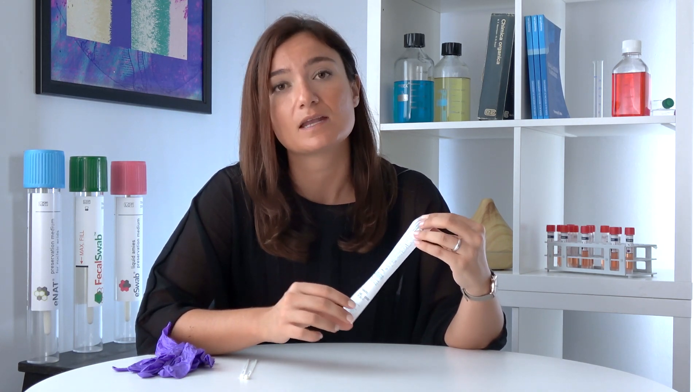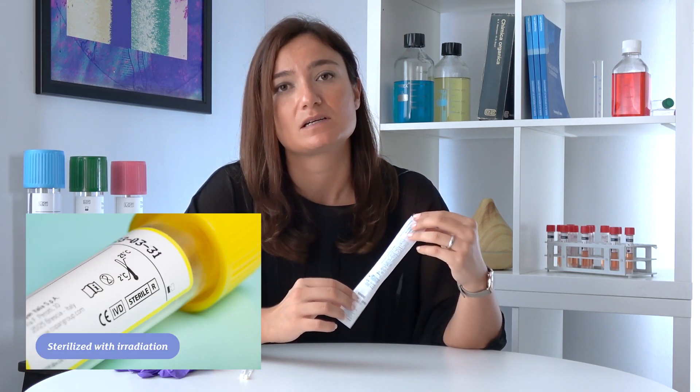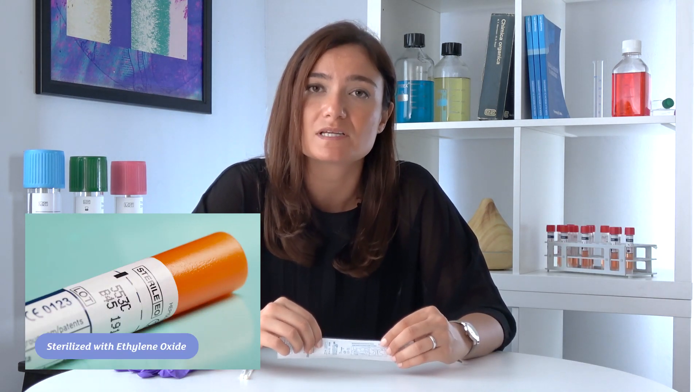If you want to know which method has been used on our medical devices, you just have to check the external pouch. Here you're going to find a standardized symbol. If you find 'Steril R,' it means it's been sterilized by irradiation. And if you find 'Steril EO,' it means it's been sterilized with ethylene oxide.